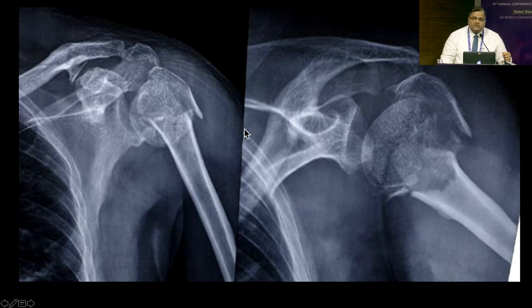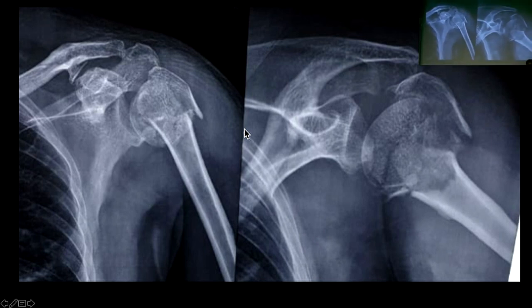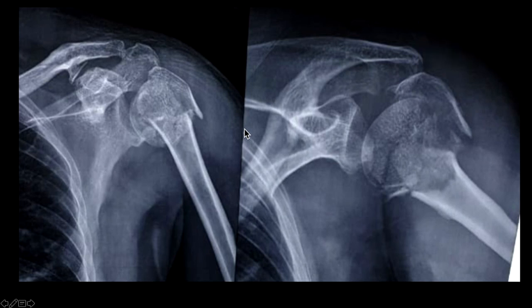Anatomical neck fracture in the elderly is again a concern, because it's a little tough to do this with a plate. So many of us start considering whether we need to replace it. We get CT scans and see that the percentage of bone is less than 30%, 25, 15 sometimes. But remember that CT scan does not give us all the information. If you can see, the head is not just rotated, it is tilted, and scans are taken at fixed definitions. So maybe at that particular position, we are seeing only some small part of the head, but the entire head is actually there. Unless it is a head split or head fragmented fracture, all the head is there.